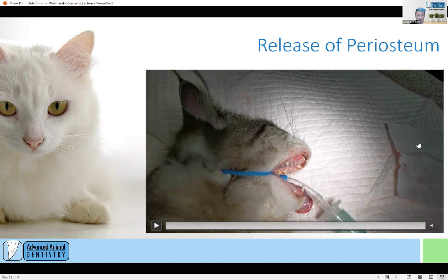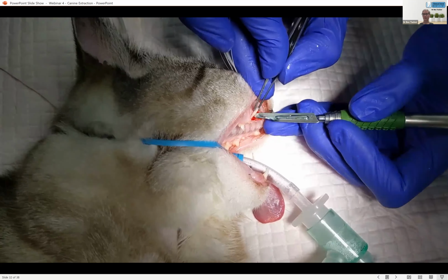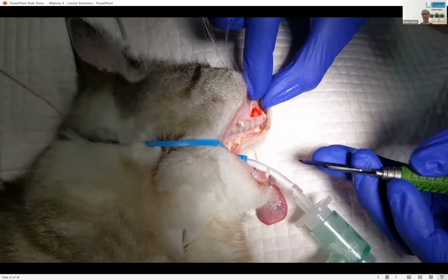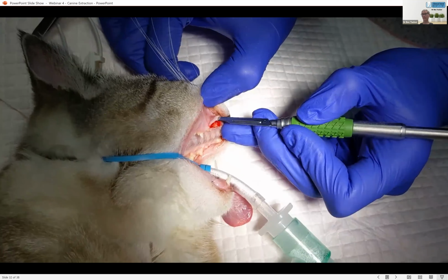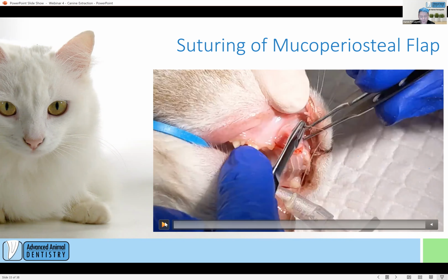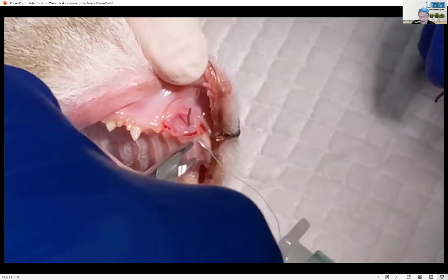So you still have to put the preparation into creating your flap and closure and the likes of that as well. Yeah, for sure. So that was, I've already run through, if you're watching, basically that's just the release in the cap. And as Aaron said, you're almost just scratching the tissue basically to release that periosteum there. And again, if you're worried or if it's a really thin flap, just do that without using your forceps, or use your fingers. Just don't cut yourself. And again, if you've prepped that all up with no tension, away you go, suture it closed.